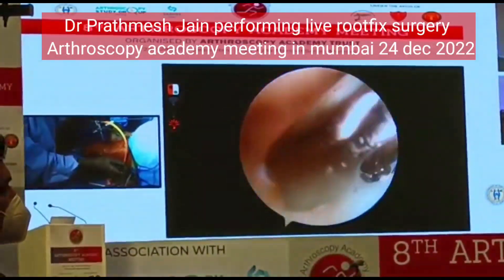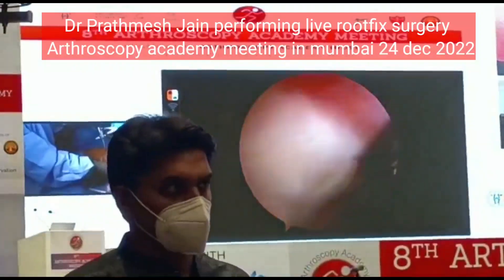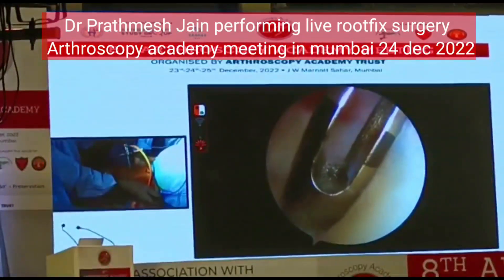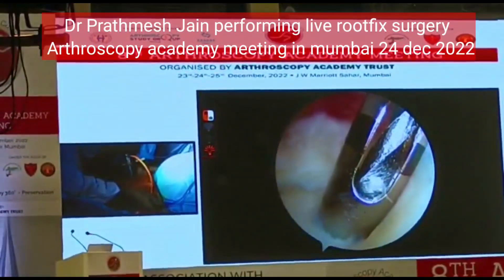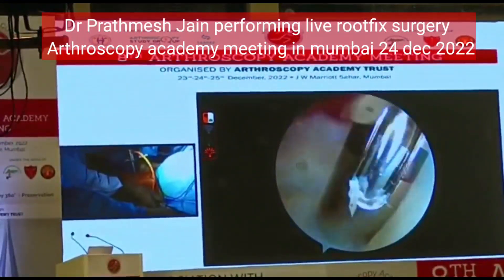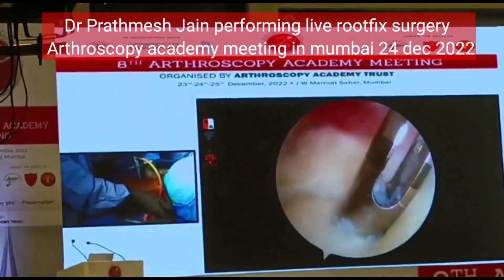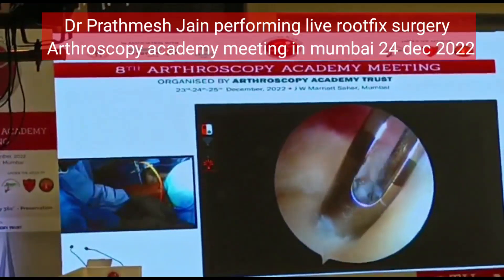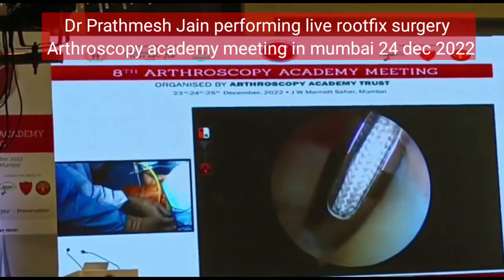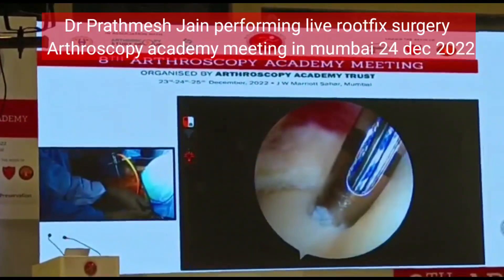What I am planning to do here is I am planning to put my anti-extrusion anchor. This is an all-suture anchor and this anchor is a double-loaded anchor. Should you put this anti-extrusion anchor after the high tibial osteotomy correction?